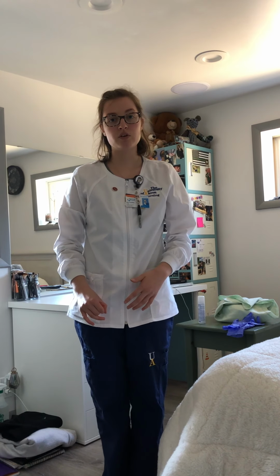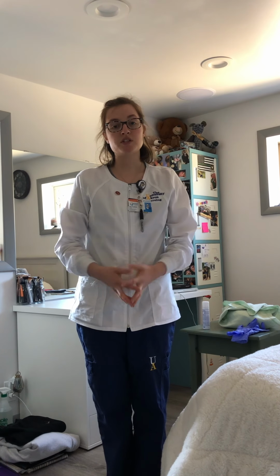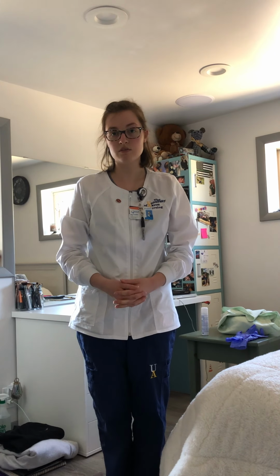But if that were not the case, I would probably try to recruit another nurse to come in and just assist me with the procedure, so it goes more easily for me and it's more comfortable for the patient. I would also make sure that the patient wasn't allergic to iodine or latex. I would see if the patient has any tubes or drains that may interfere with me properly performing the procedure. We don't want to get anything confused or anything tangled up.